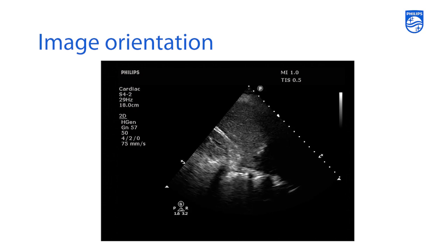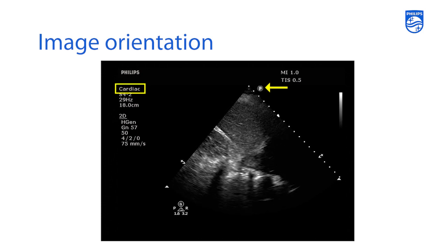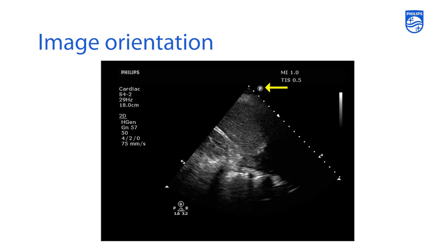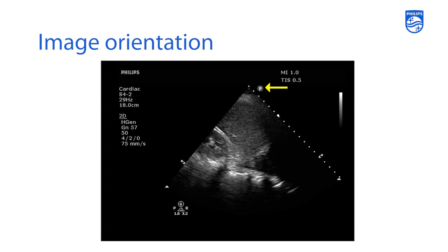One technical detail to note: the orientation marker is on the right-hand side of the screen in this image because the exam was started under a cardiac preset. In cardiac ultrasound, the orientation marker is always on the right-hand side of the screen. In every other ultrasound evaluation — whether lung, abdominal, or vascular preset — the orientation marker moves to the left-hand side of the screen. This is the classic difference between cardiac imaging acquisition and other imaging in ultrasound.